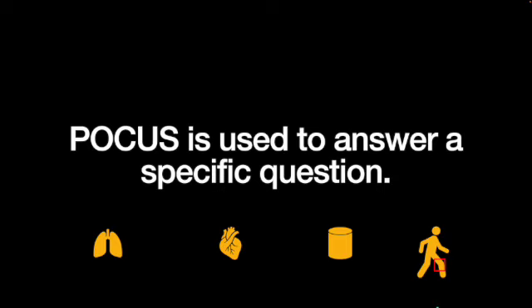Point-of-care ultrasound, as you may know, is used to answer very specific questions or a set of questions at the bedside, as opposed to comprehensive ultrasound examinations, which are ordered and performed in the radiology suite. Our goal with point-of-care ultrasound is to answer a very specific question to help us narrow down the differential in patient care. It differs from comprehensive ultrasound in that the individual who's performing the point-of-care ultrasound is also interpreting it and integrating it into medical decision-making.